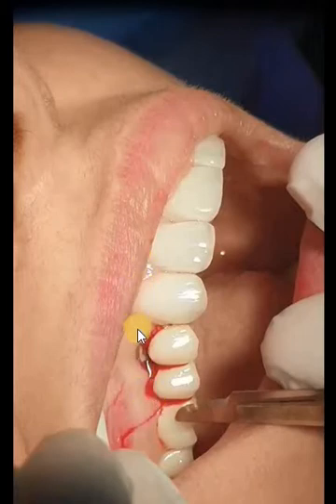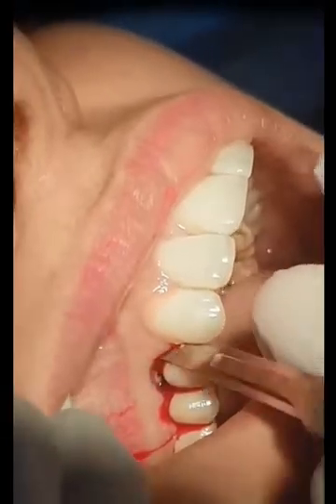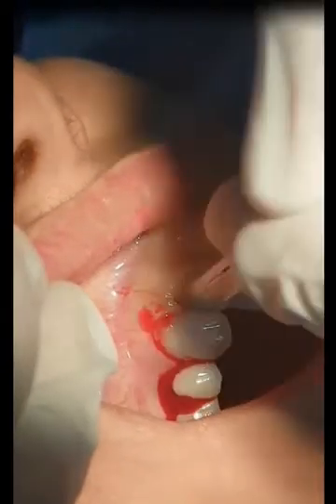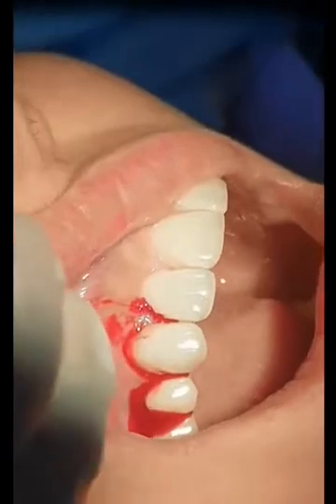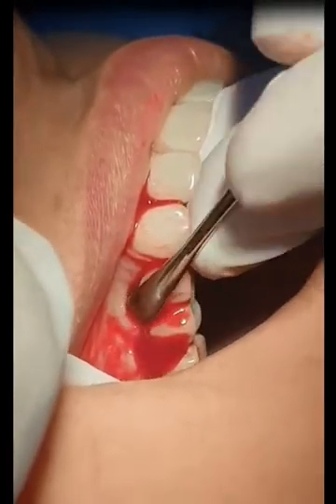Why? Because we put bone grafts and membranes here, which causes tension on the tissue. So to make the area free to release, we involve one tooth in the back and one in the front while doing the incision. The full mucoperiosteal flap elevation should be at least 5 mm beyond the edge of the bone defect. This is how we do the vertical incision — reverse bevel incision to release the papilla. And we are using the mucoperiosteal flap to release the tension and reflect the flap.